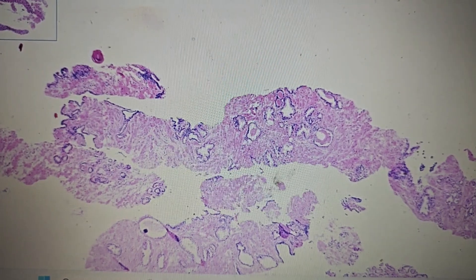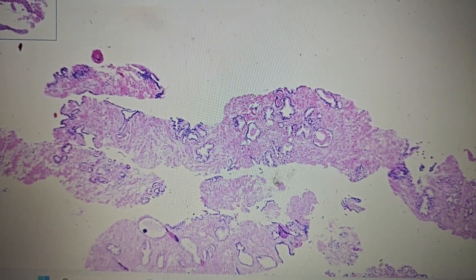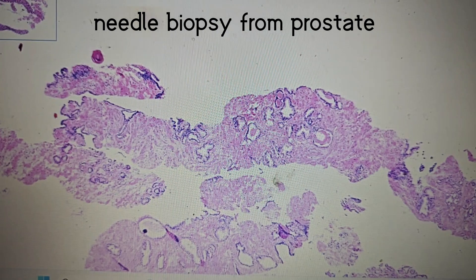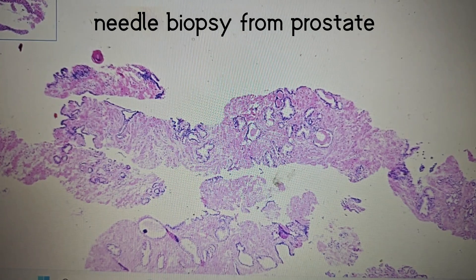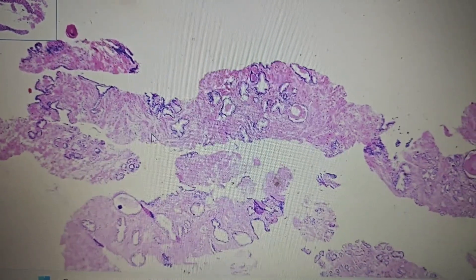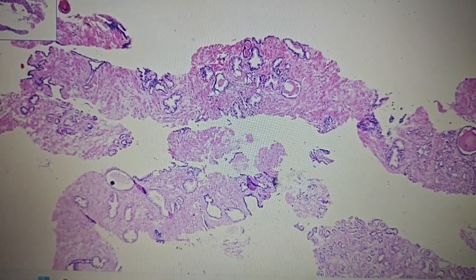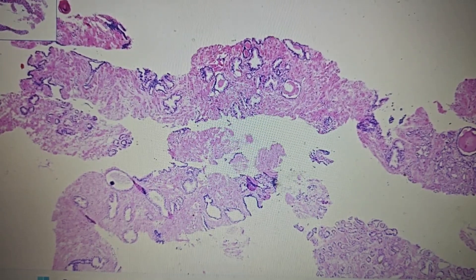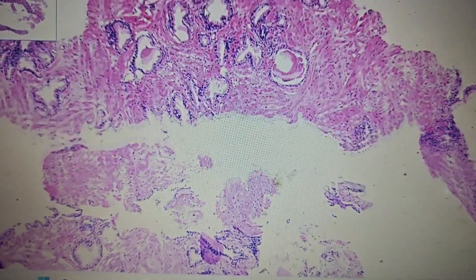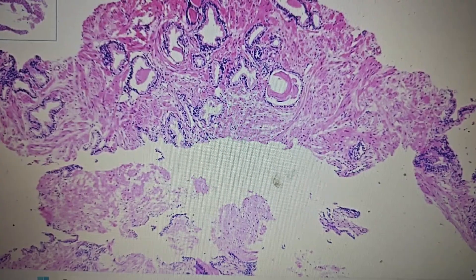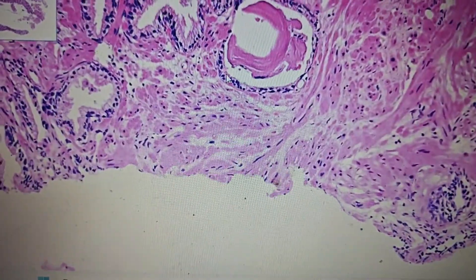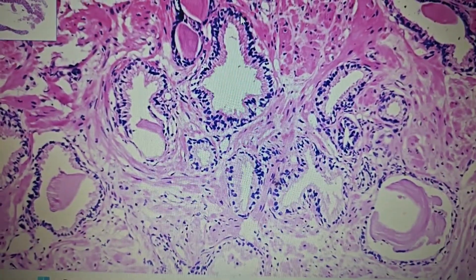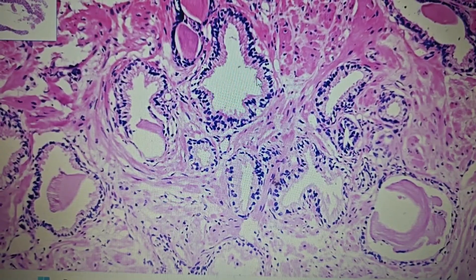Hello and welcome everyone. Here we are taking a case of a needle biopsy specimen from the prostate. We can see the prostatic tissue, which is made up of glands and stroma. Let's zoom in to see the architecture and cytology of these glands.